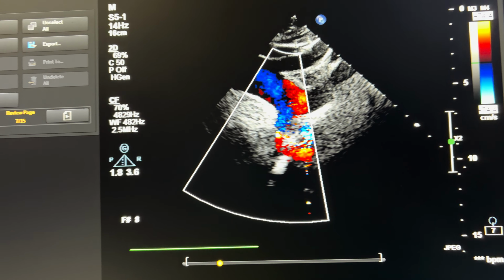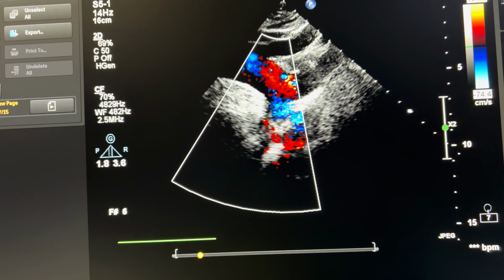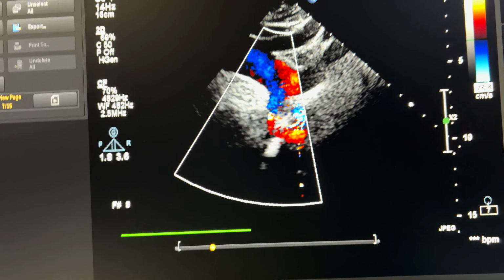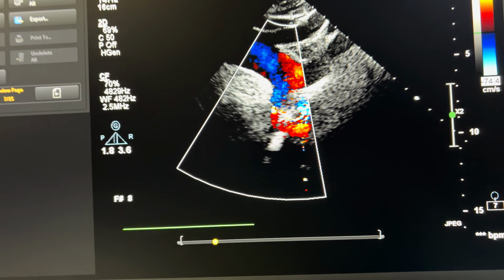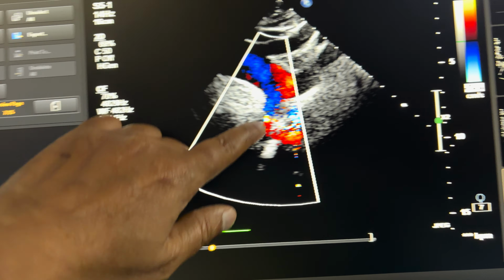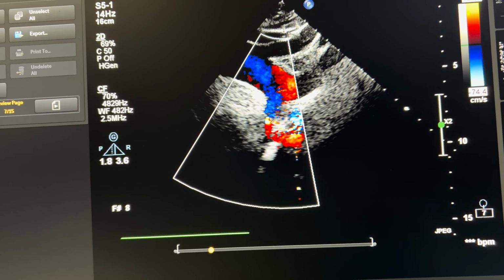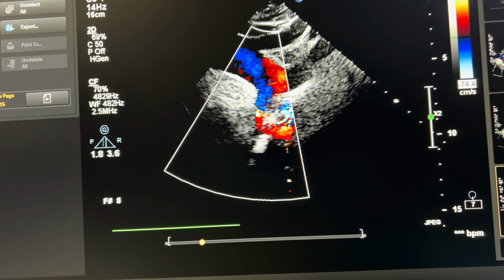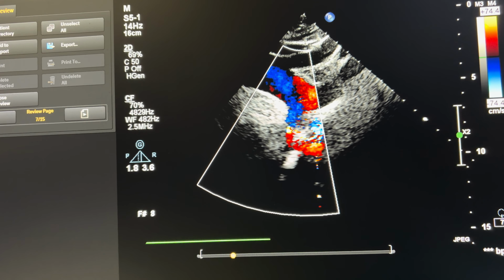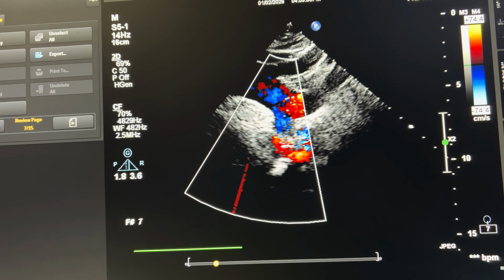So if you take blood pressure in both upper and lower limb, especially whenever you get a case where the blood pressure is not easily controlled, then coarctation will not be easily missed. At the same time, as this part is very narrow, very small in size, you have to localize and focus on the area when you are performing continuous wave spectral Doppler. That should be the point to understand in this case.